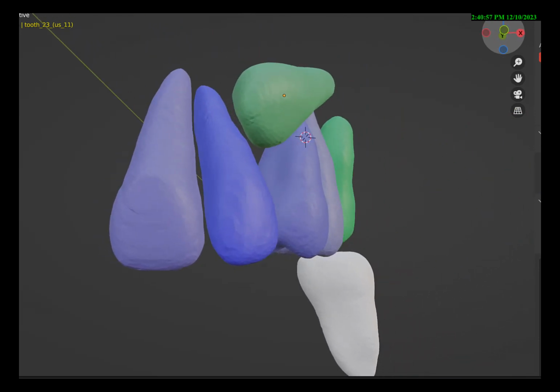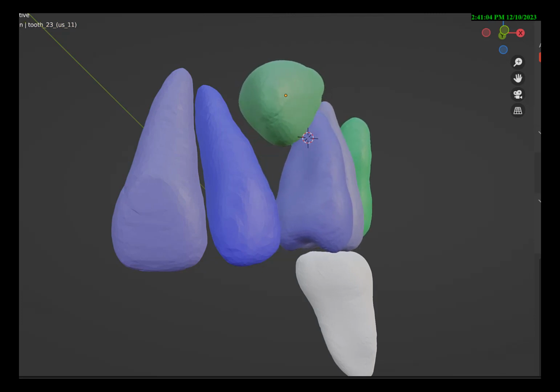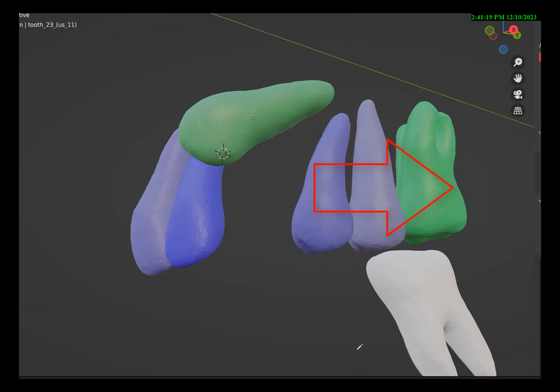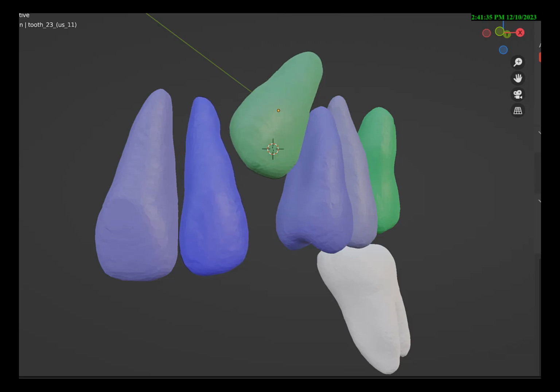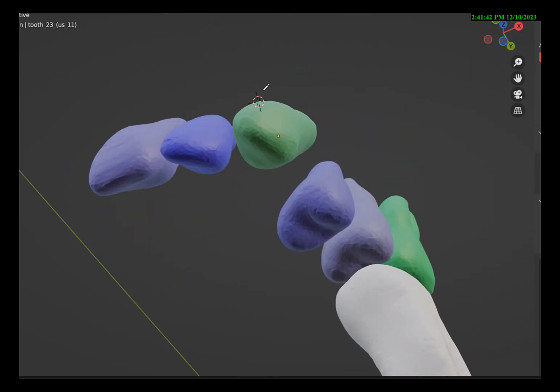If you look closely, the first movement that needs to be done, from this perspective, is to get the canine out of the root of the lateral incisor while at the same time distalizing the premolars and molar. Once the canine is out of the trough of the lateral root, you can start moving the root of the lateral incisor and the crown of the canine at the same time, at the same rate, to get into a much better position. But remember, you still have to correct the transverse problem that you could not do before because you had the lateral root to take into account.